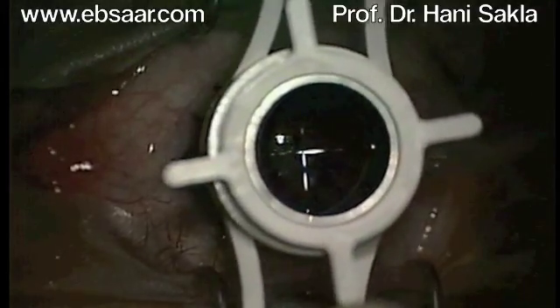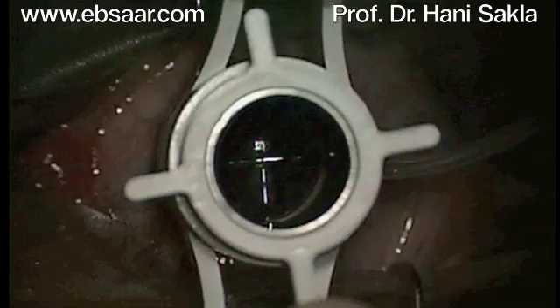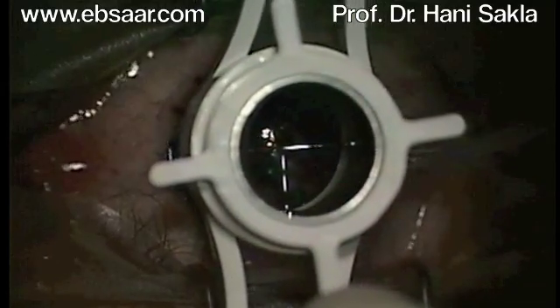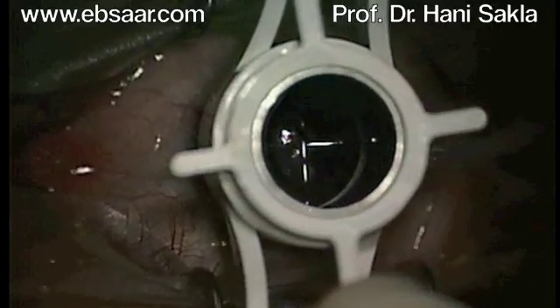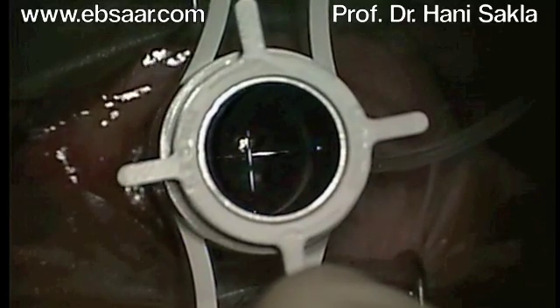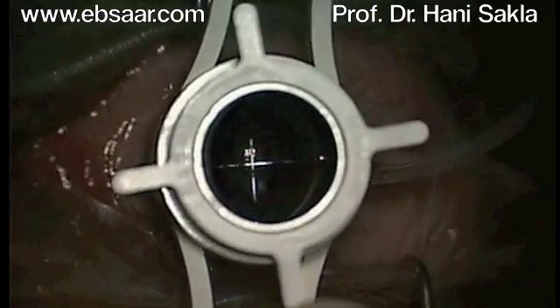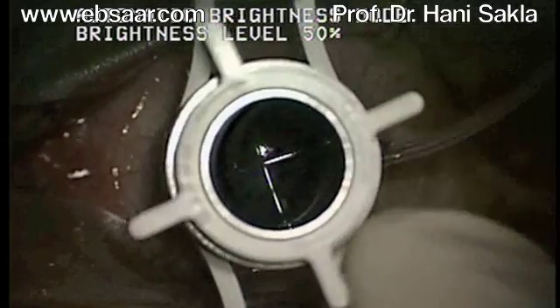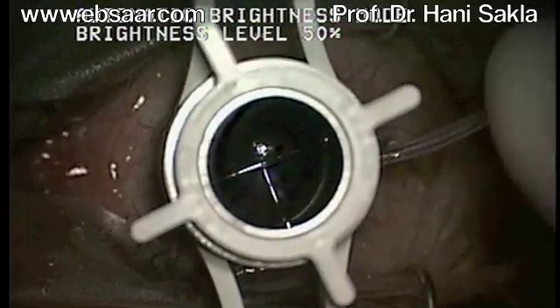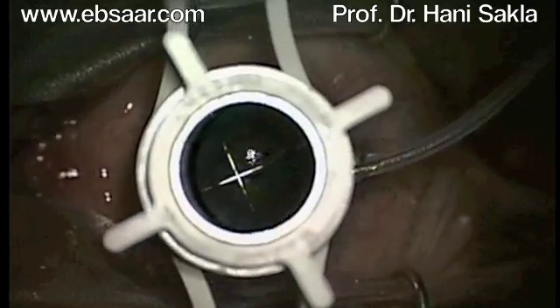We perform partial trephination about two-thirds of the corneal thickness using the Baron trephine. Each quarter-circle turn is about 60 microns. The first four quarter-turns only bring the blade into contact with the cornea; the following turns are the cutting ones, resulting in a trephination of about 300 microns.